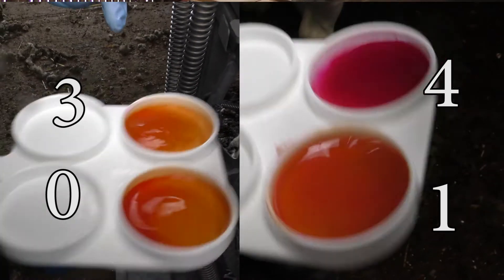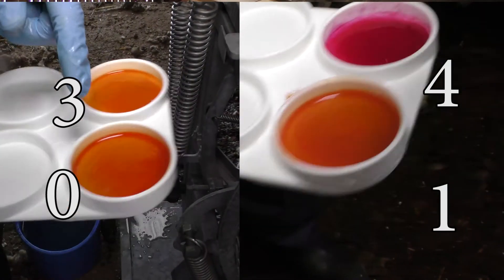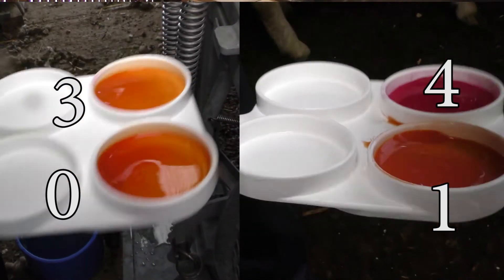The aim is to categorise the mixtures into five different categories, zero to four. Zero being no presence of mastitis, four being a very high presence of mastitis.